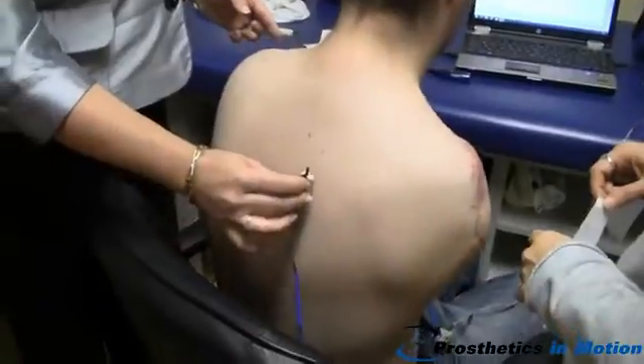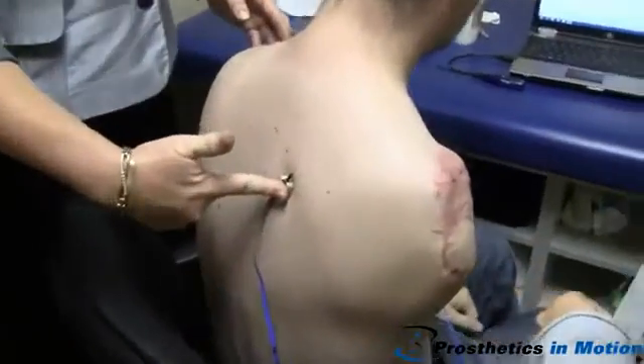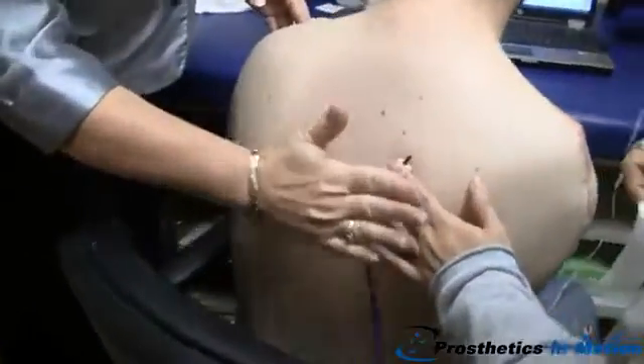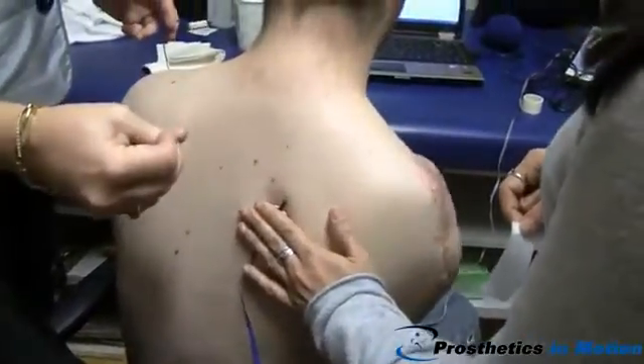Bring straight back and relax. Now look at the screen for us — I'll give that to you, Clarabelle. You want to try to put even pressure on the electrode when you're testing. It's even okay to put your entire hand on her, like you're the socket, because it's going to interpret the whole action potential of that muscle.